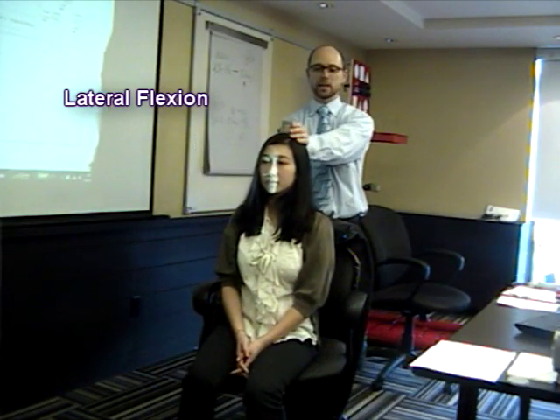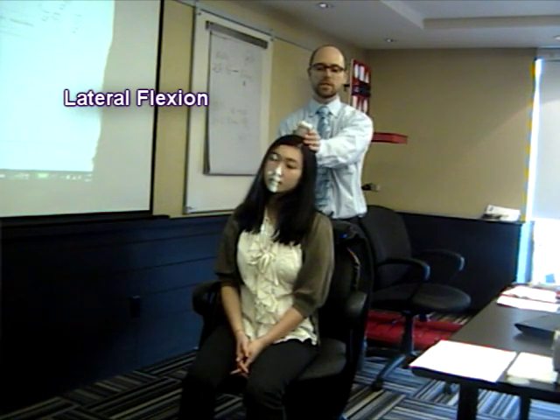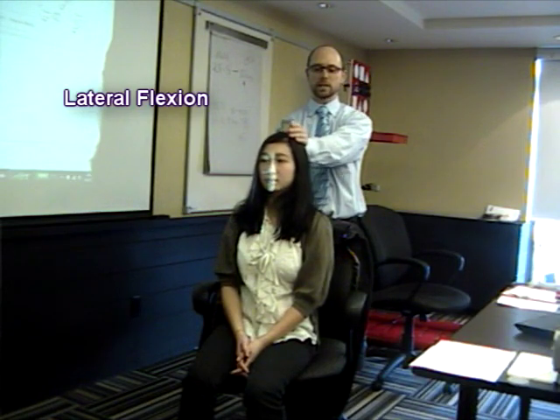Up on top. I'd set my inclinometers to zero and off to the left-hand side first, and then to the right-hand side.